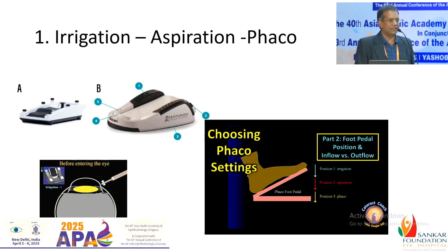Here we have to understand whether each of our machine is having the linear flow in the vertical direction and also in the horizontal meridian. Sometimes even in the vertical position, we can do further customization to get something similar to non-linearity or three-dimensional aspects. That is something I will show you towards the end of the presentation in a video.